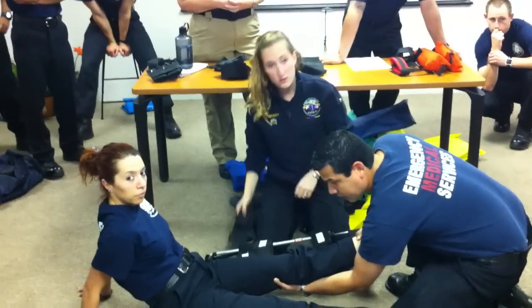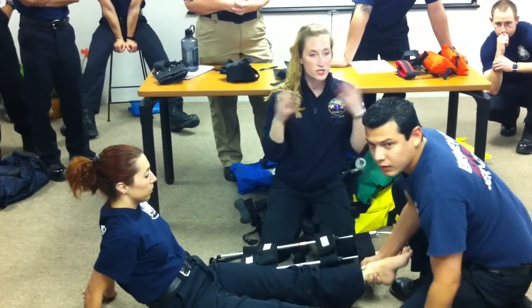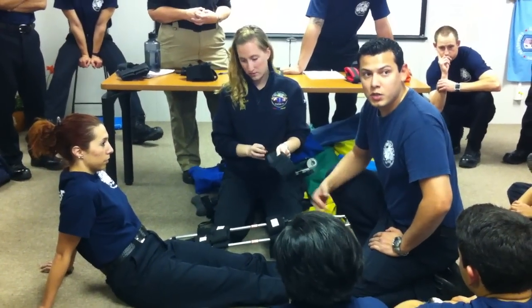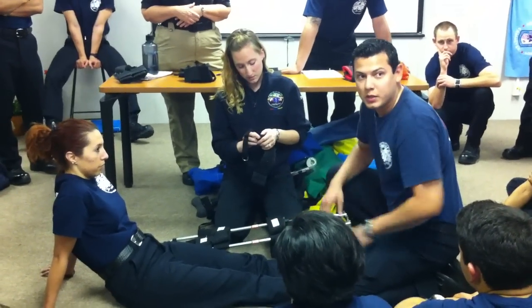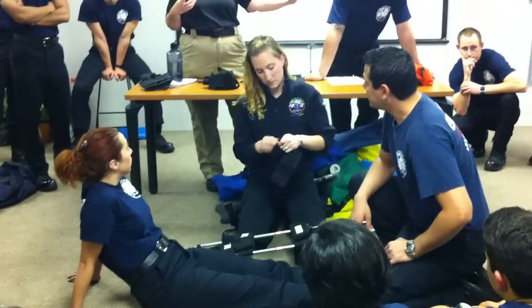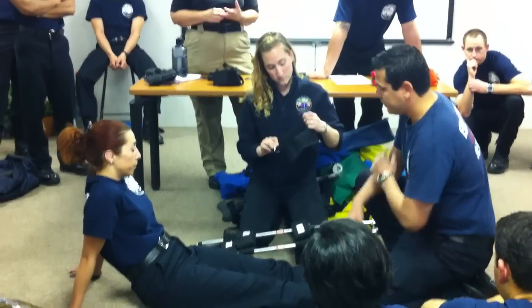Then how would she stay if you're pulling? Well, she's got to brace herself, but we're trying to show you you're using that much force to actually pull the bones apart. If need be, use extra people. Have someone hold her. She's wearing slippery pants and this carpet is easy to slide on, so keep those things in mind when you're giving traction, because you will pull the patient towards you. Manually, you have to pull traction enough to pull those bones apart yourself until the machine takes over the device.